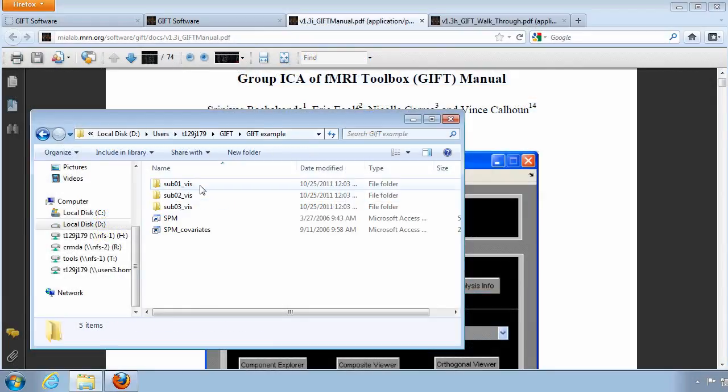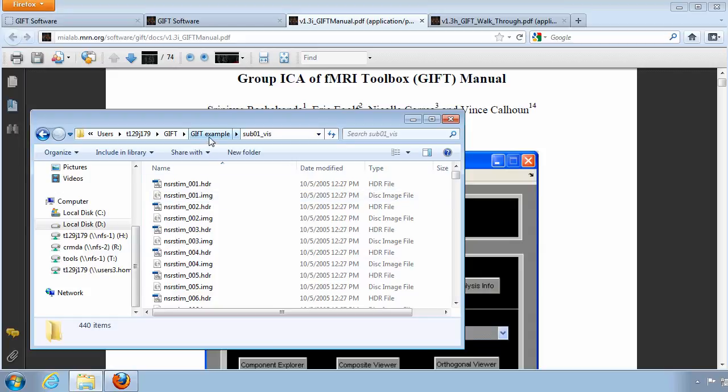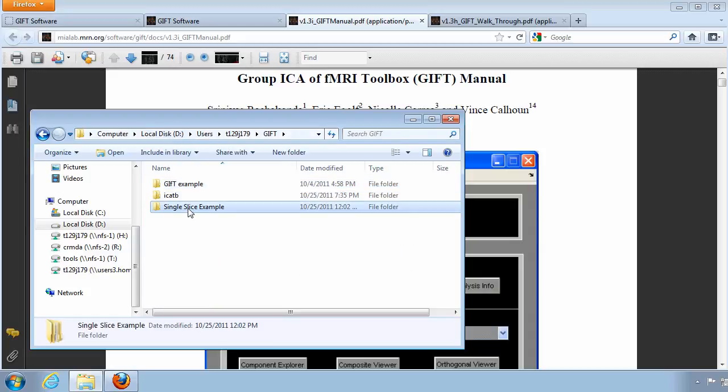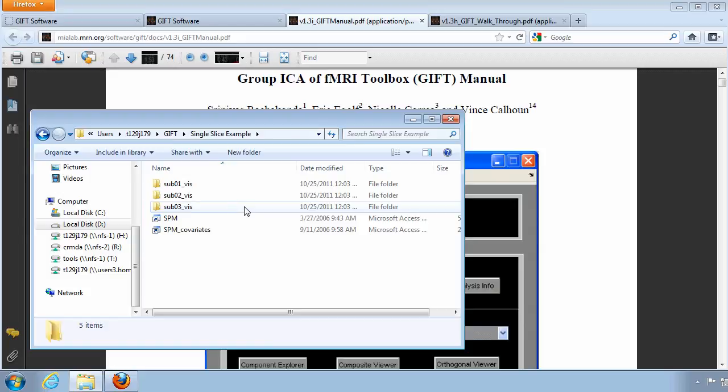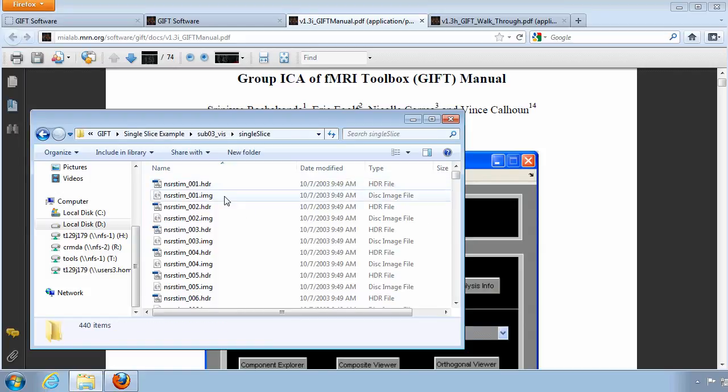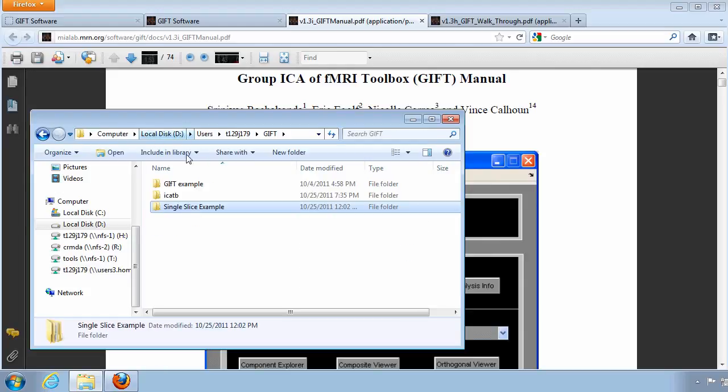If you open your example data, you will notice three folders, one for each subject, and another folder with the single slices from the same experiment. You can move or delete the single slice folder, because we want to make sure the Toolbox finds the correct files to analyze.